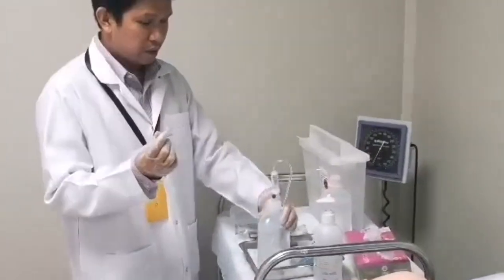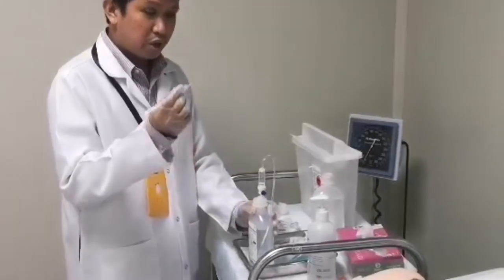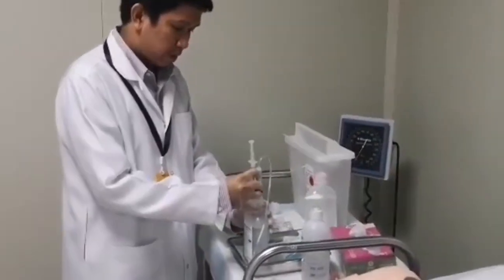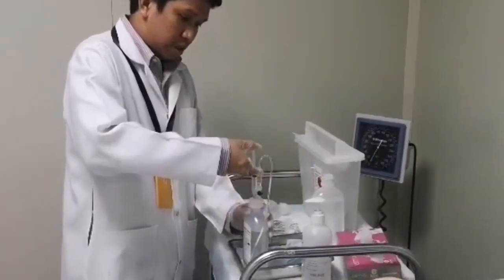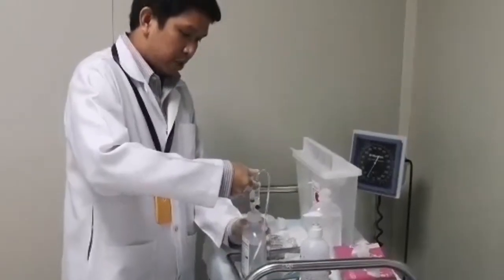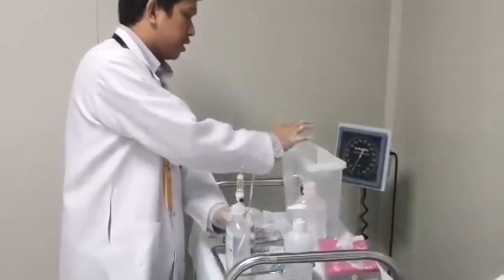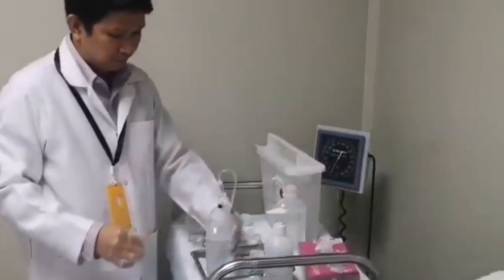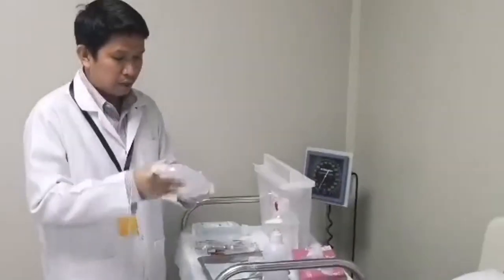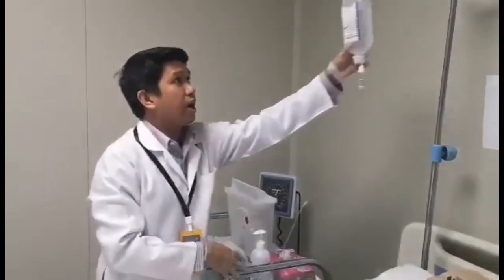Uncap the needle of the syringe. Steady the solution bag with your non-dominant hand, and using your dominant hand, inject the syringe on the injection port. Gently push the IV medication into the container and directly discard the syringe. Gently rotate or agitate the IV solution bag to mix the medication with the solution, and re-hang it on the IV pole.